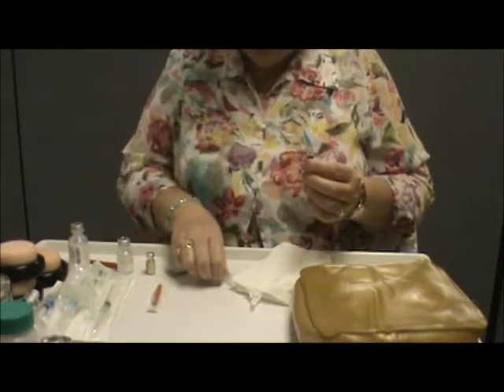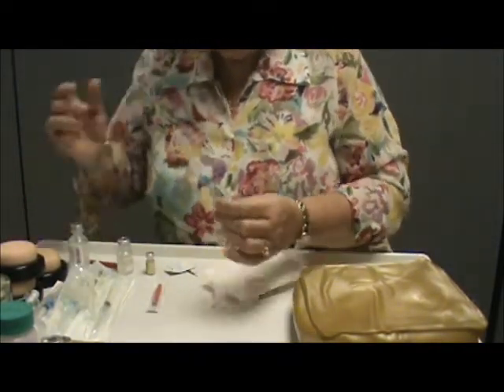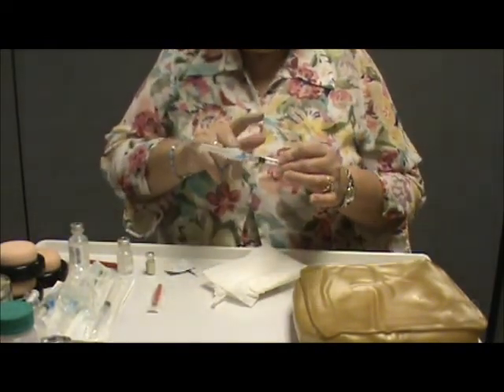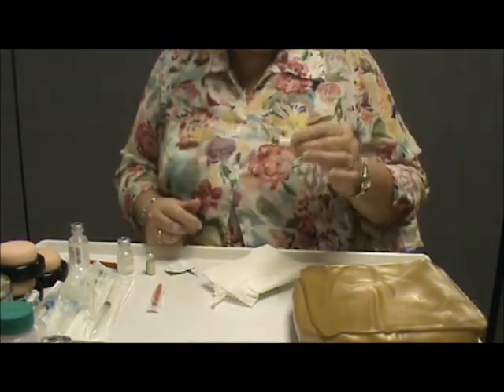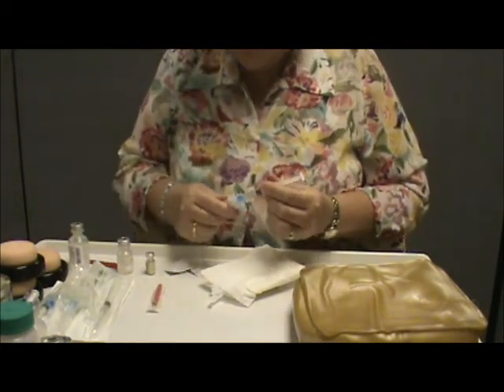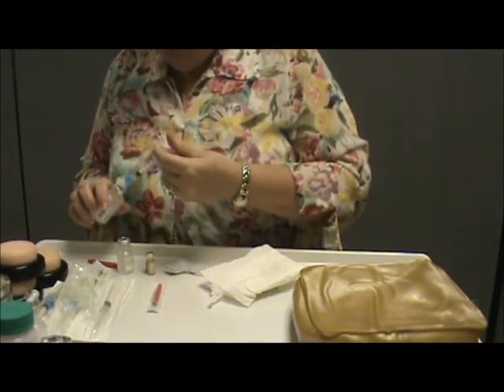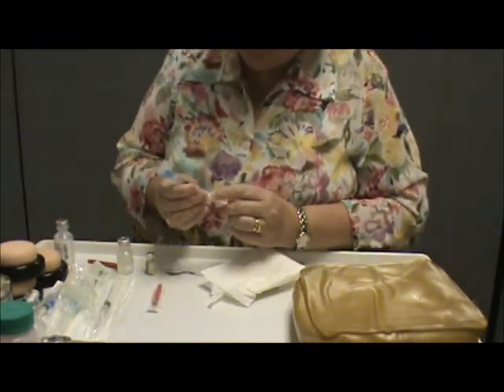So then we are ready to recap, and we want to label appropriately with the medication, the dosage, and the patient name, and then we're ready to take it to the bedside. Alright, I'm not going to inject fluid into this pad, so I'm going to put it back in here, and replace it with air.